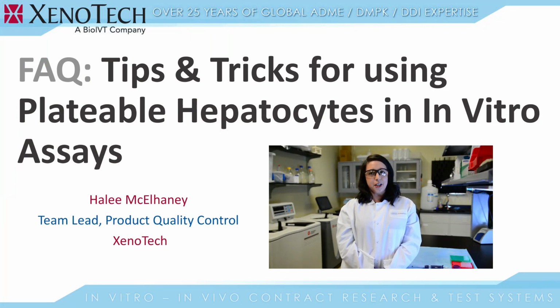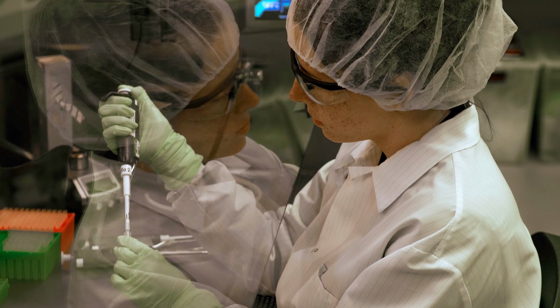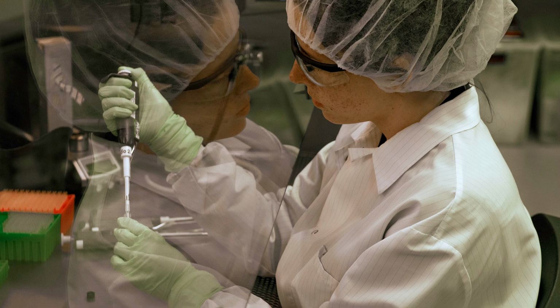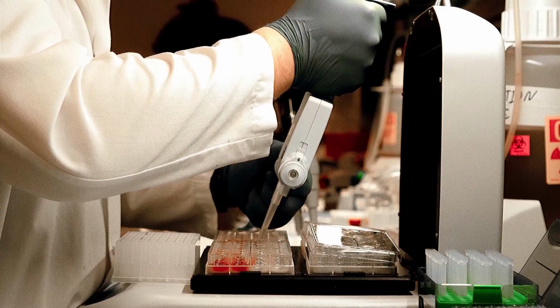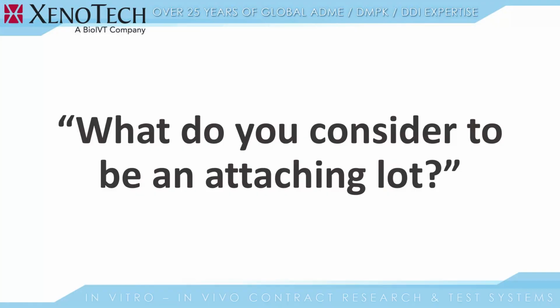McElhaney, and today we are talking about plateable hepatocytes. We get a lot of questions from clients, and today we're going to discuss a few of these. Plateable hepatocytes have an array of uses. One common use is for induction studies. However, there are many other applications as well. You can use plateable hepatocytes to look at metabolism, biochemistry, virology, and cell biology. These are not just for drug development.